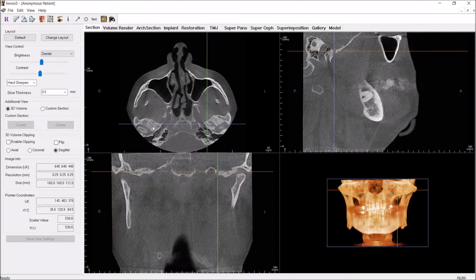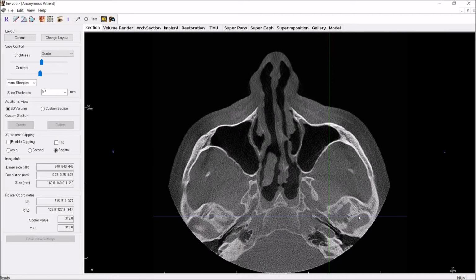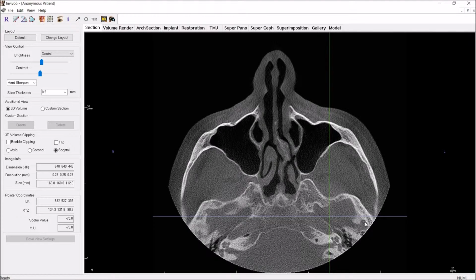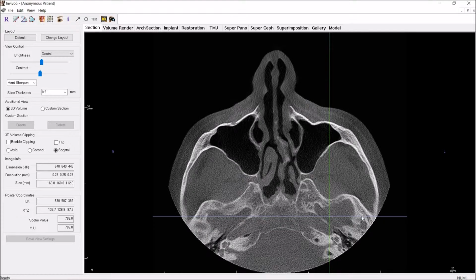And then sometimes you just get kind of enlarged trabeculae. As we scroll up, this looks a little different. This looks a little more concerning than something that I would just classify as enlarged trabeculae, especially now. It just keeps opening up more and more. And here we see another one. Okay, we'll get back to that.